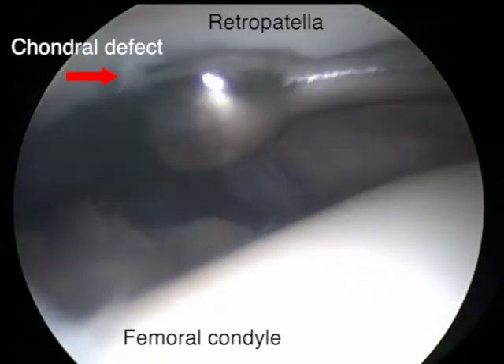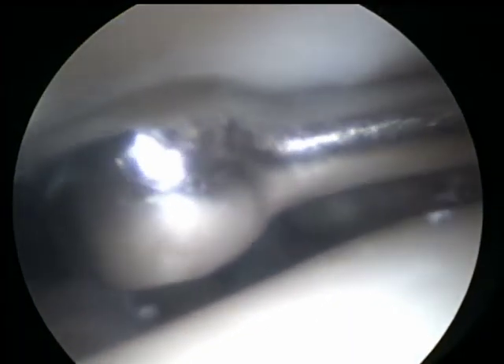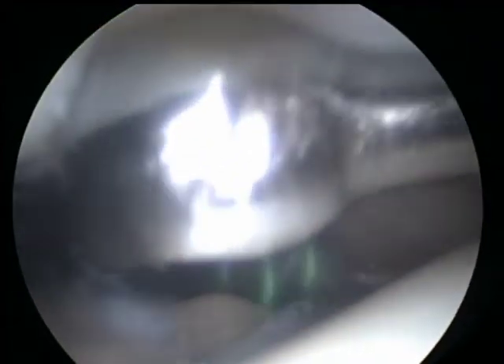Now we will move on to part two of the video, introducing problems with the traditional technique. In this first clip, the debridement of the area of the lesion is being attempted using a ring curette. However, this step is made difficult due to the hypermobility of the patella, causing the curette to slip when an increasing amount of force is being applied.